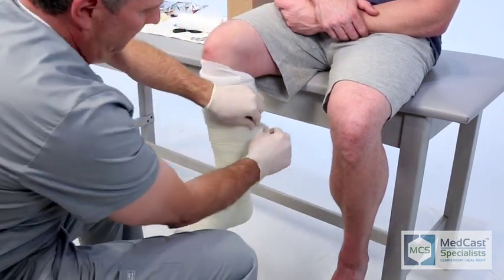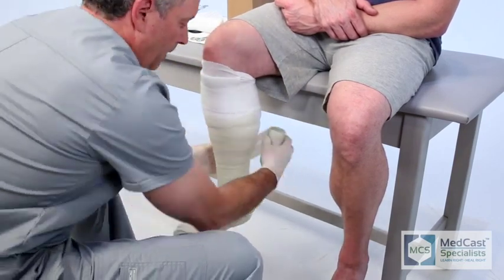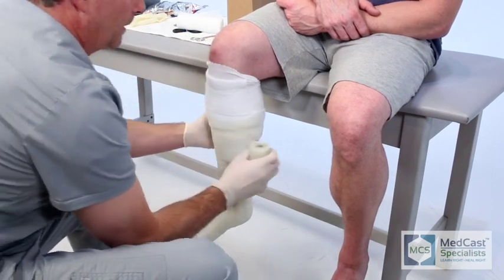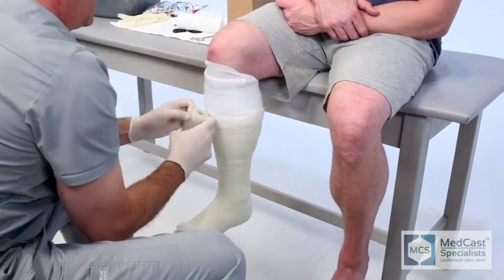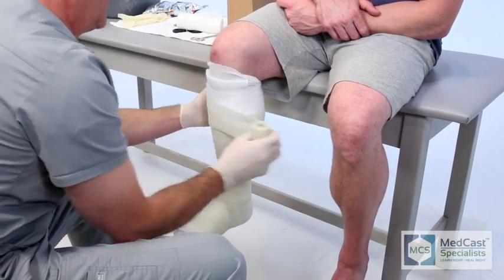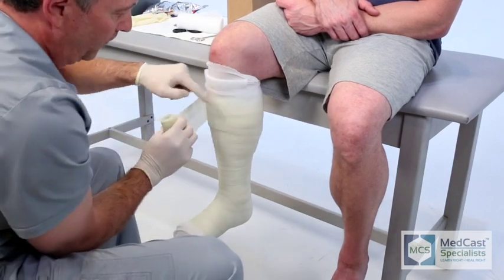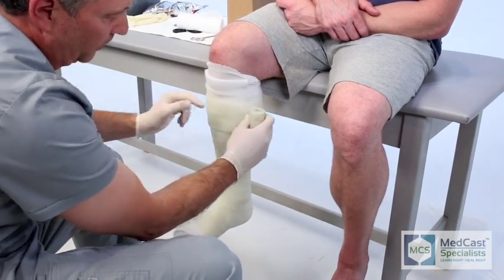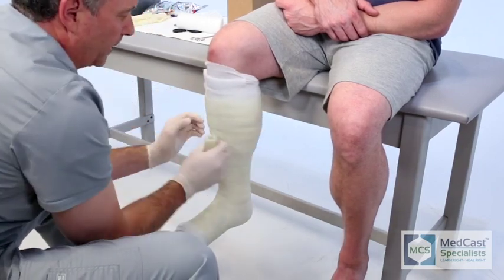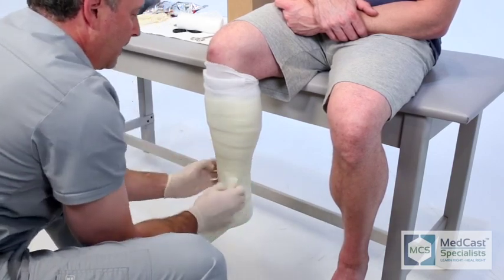If you get your roll fully inundated with water, you don't generally have the type of pulling-away flaw where you turn your back and it starts to unravel and you have to come back and reposition it. If you allow your roll to get fully wet — once the bubbles have stopped, that's usually an indication that it's thoroughly wet all the way through from the outer portion of the roll all the way to the inner portion — a lot of times you won't have that unwrapping effect; it'll stick a little better.